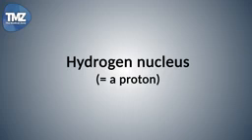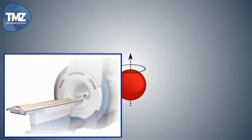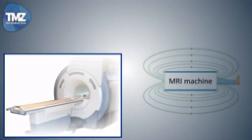Hydrogen nuclei, or just protons, are present in water, which is very abundant in the human body. MRI can use the proton's natural magnetic properties. The proton behaves like a small magnet, spinning on its randomly aligned axis. So what do MRI scanners actually do? They create a magnetic field, of which the strength is measured in Tesla.